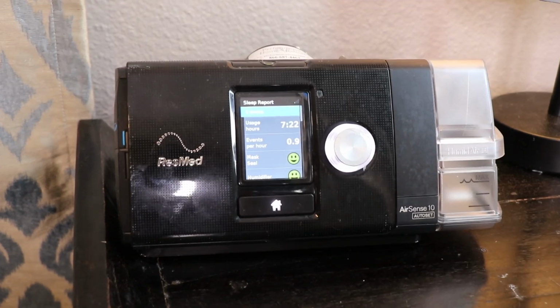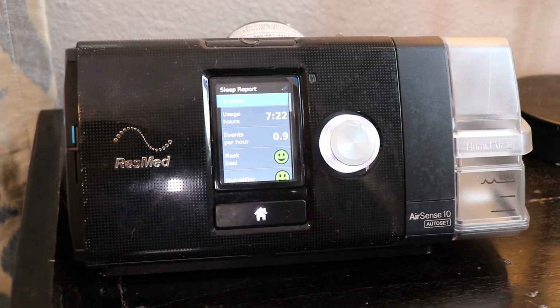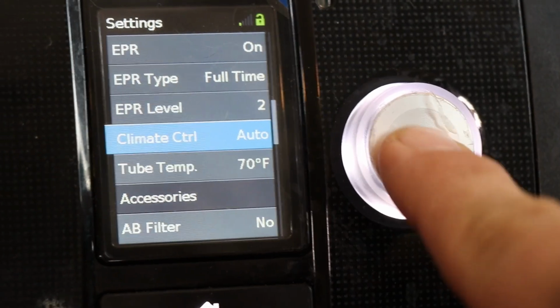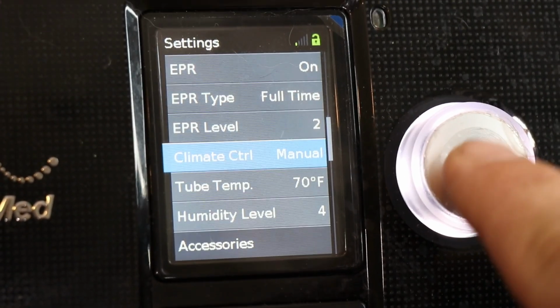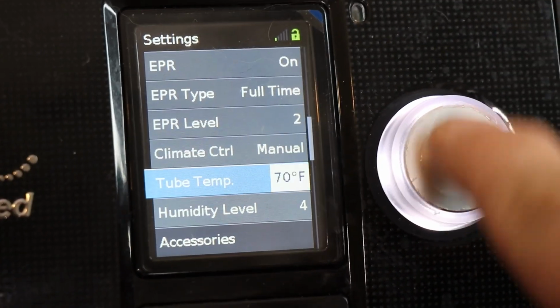So what you want to do is look up the instructions on the model of your CPAP and figure out how you could change those 2 settings to manual. Once you find those settings, just go over to both the heater and the humidifier and turn them off.